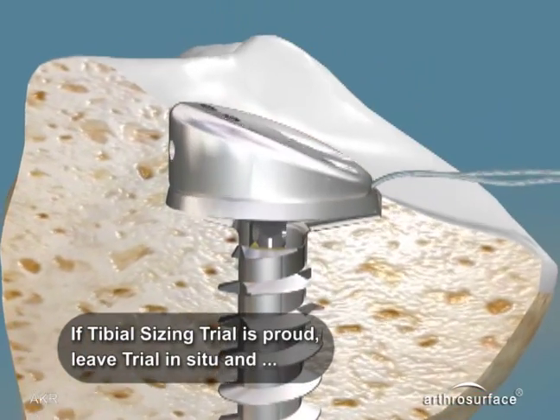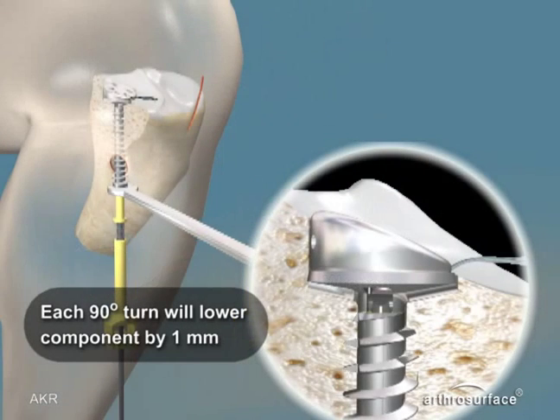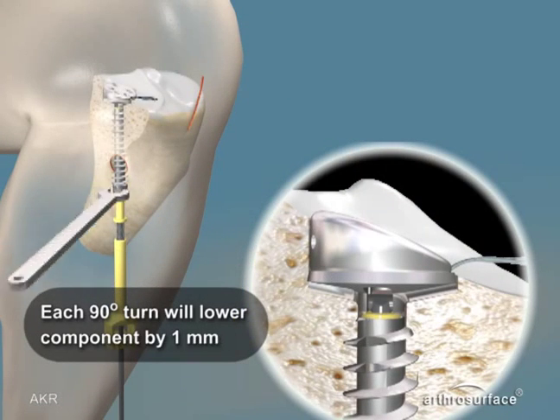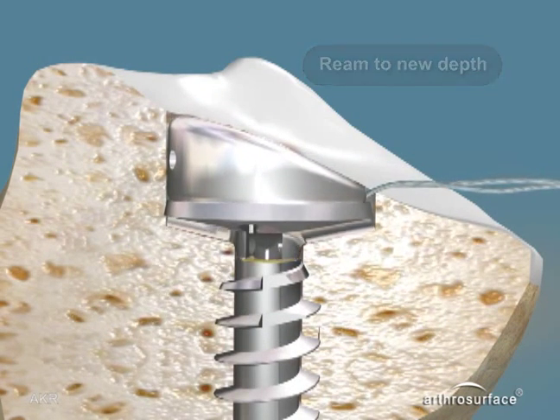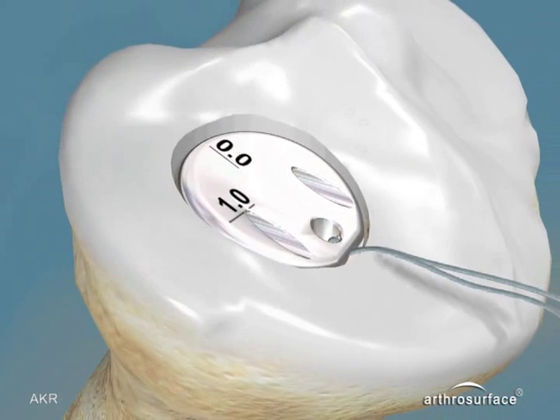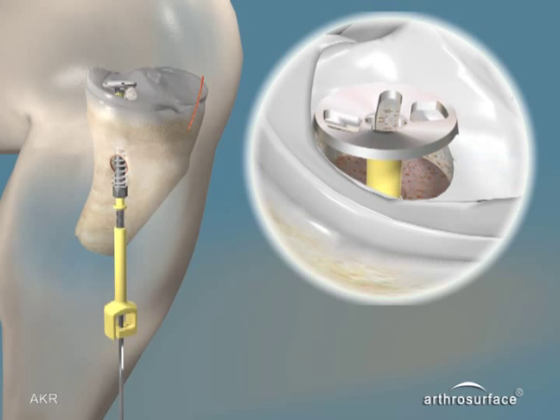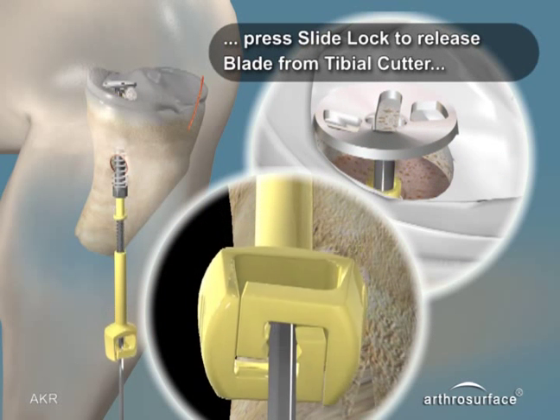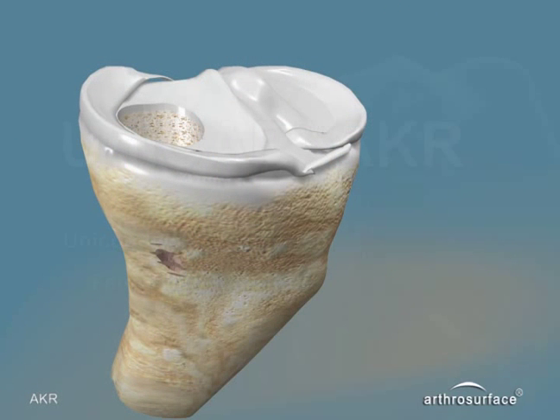If the trial is proud, leave the trial in place and, using the wrench, attach it to the blade stop. A 90-degree rotation will lower the blade stop by one millimeter. Reattach the drill, ream to the new depth again stopping on the top of the blade stop, and confirm the fit of the tibial trial. When satisfied, remove the trial, the blade, and the tibial cutter shaft. Preparation of the tibial side is now complete.